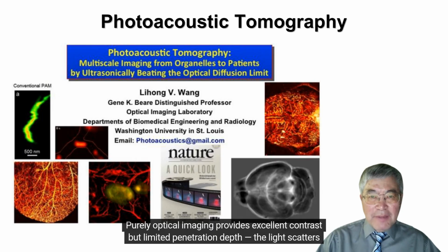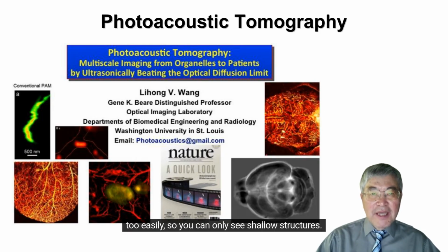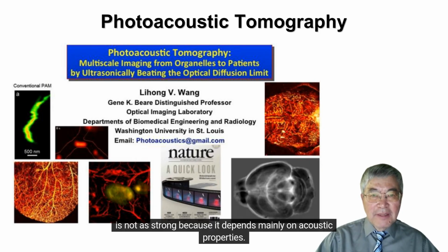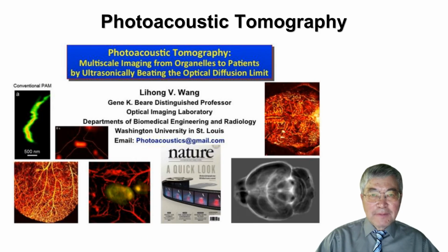Purely optical imaging provides excellent contrast but limited penetration depth. The light scatters too easily, so you can only see shallow structures. Ultrasound, on the other hand, penetrates much deeper and gives good spatial resolution, but the contrast is not as strong because it depends mainly on acoustic properties.